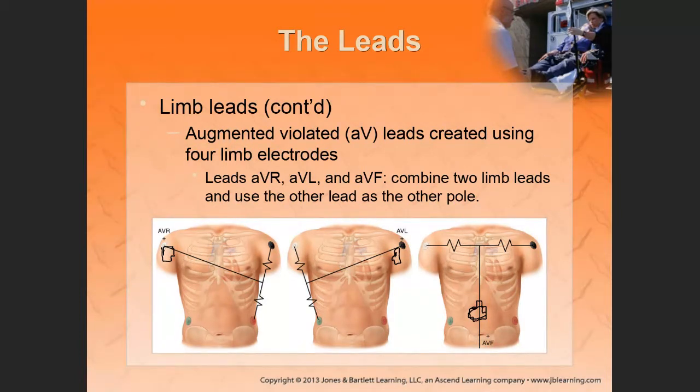Which side of the heart does AVR look at? Right side. And which side does AVL look at? The left side. All right, good.